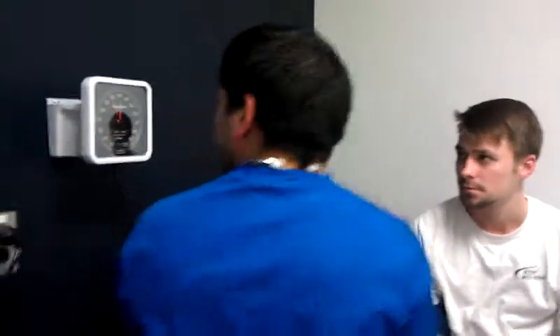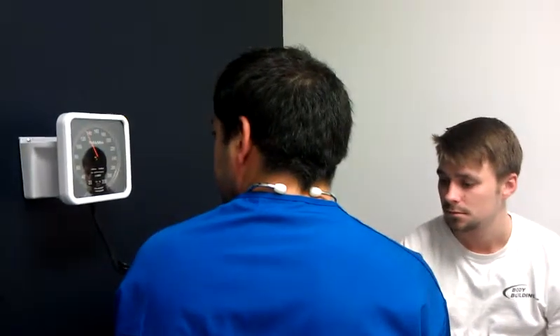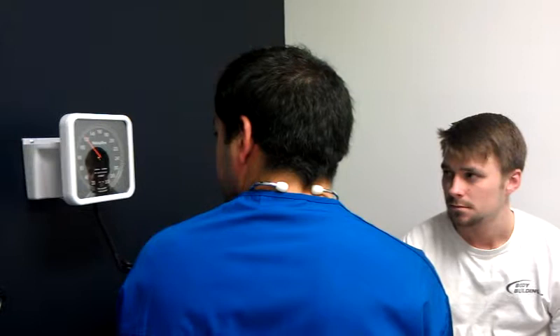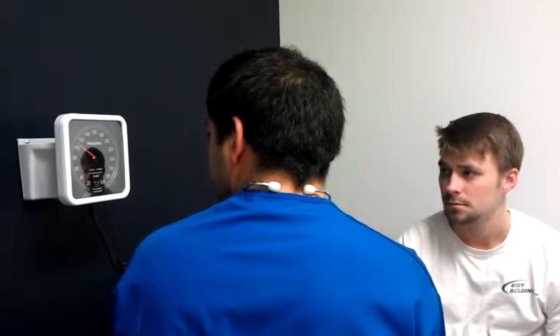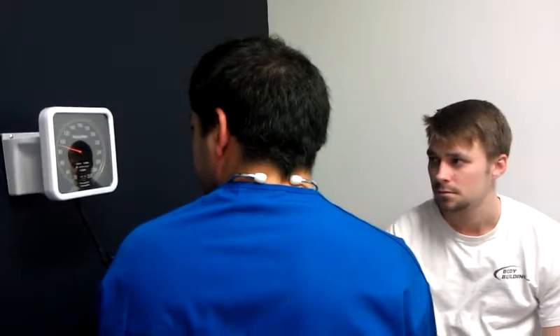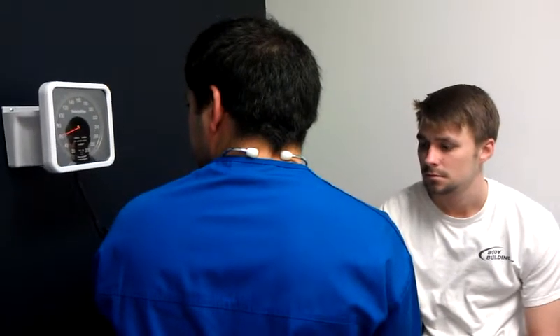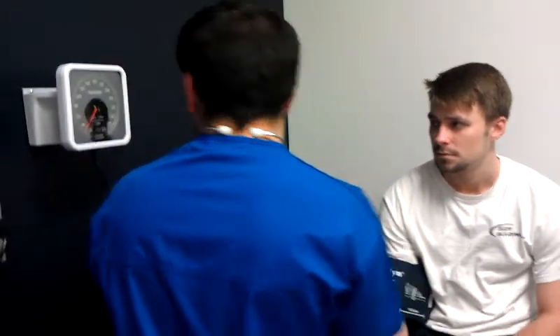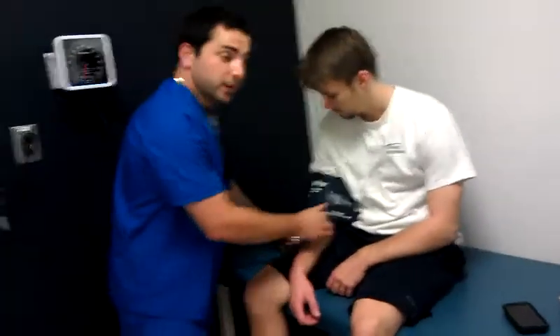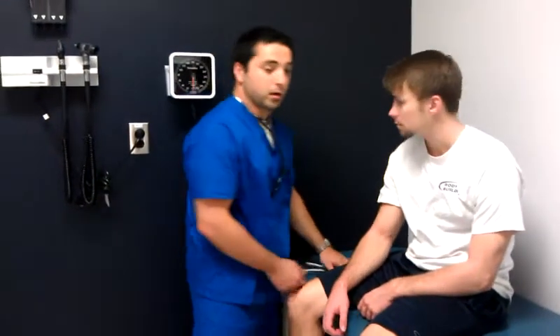It's important to note the number when the patient's pulse fades. Okay. It faded at 85, so it's important to pump it up to add 30 millimeters of mercury. We're going to let that sit down there for 30 seconds or so.